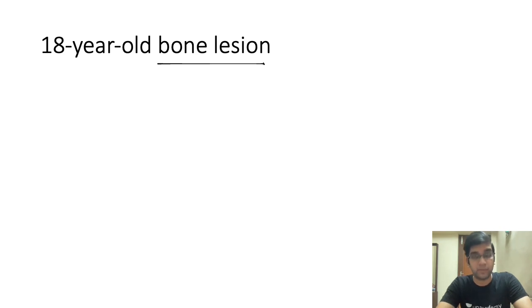So clinical, histo-radiological correlation is very important to rule out many lesions. The site might be confounding sometimes, I might not have the exact age sometimes, but definitely radiology will help me in differentiating whatever differential diagnosis you have in mind. And sometimes the differential can be a totally benign lesion which doesn't require anything, to a malignant lesion which might require amputation, right? So the management will drastically differ. So I want you to take the input of the radiologist for any lesion. Fine.